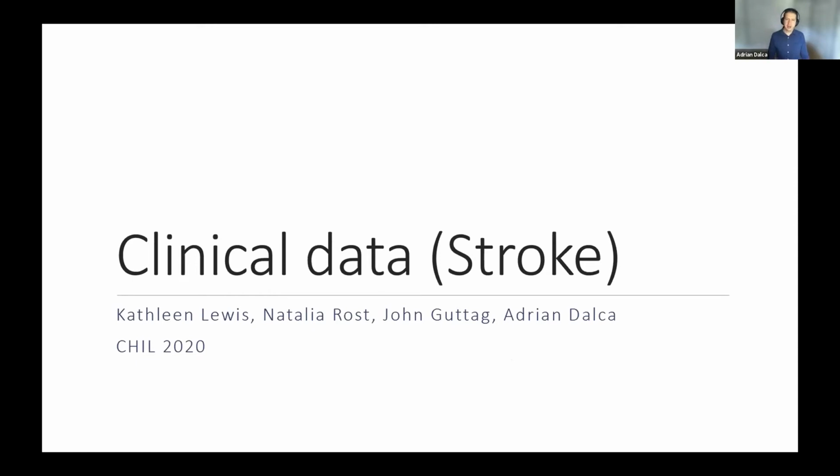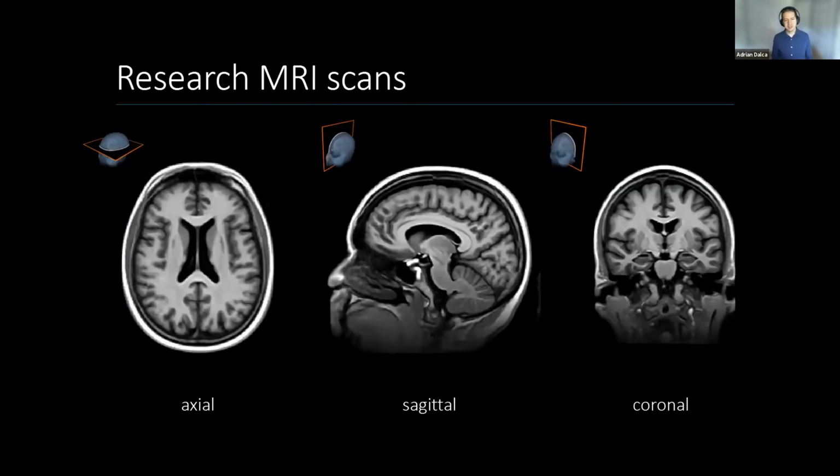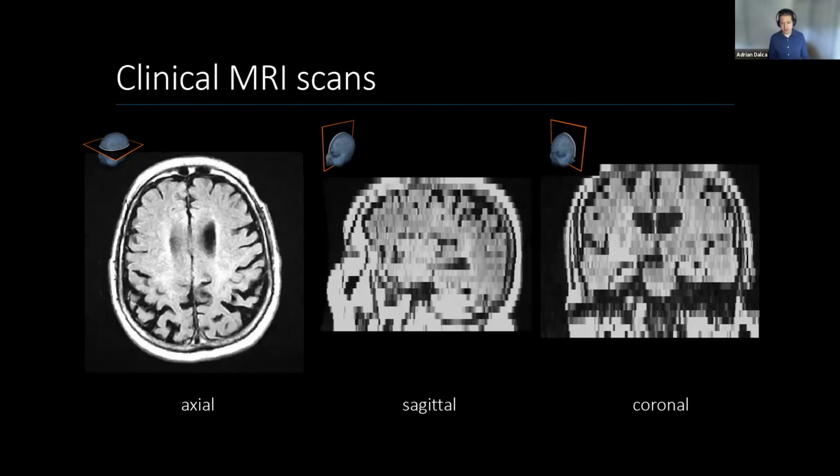Now, at MIT, we tend to work with these really pristine, really beautiful MRI images that we got from all kinds of different data sets, ADNI and the like, where images are acquired very carefully and they're clean and they're processed and all of that. So they look really nice, and that's really awesome. But clinical images are of a different sort. These are the images I was dealing with. They're slightly different, right? Lower resolution, a lot more noise, a lot more artifacts, there's motion, they're chopped off, all these sort of things. So the question was, how well can we deal with this?